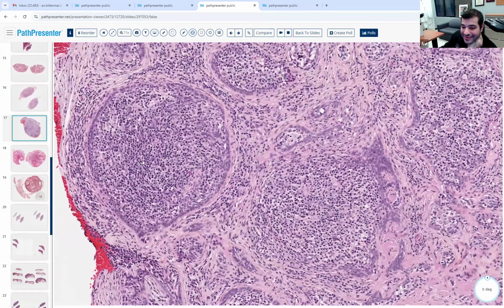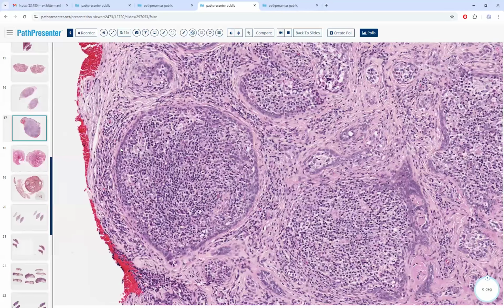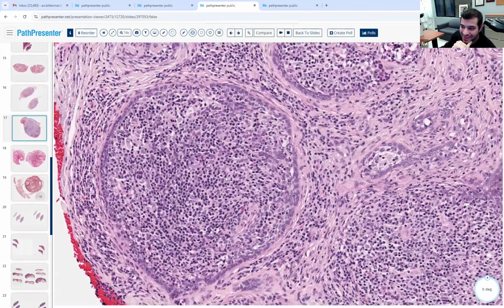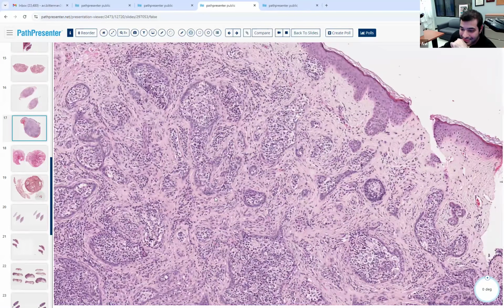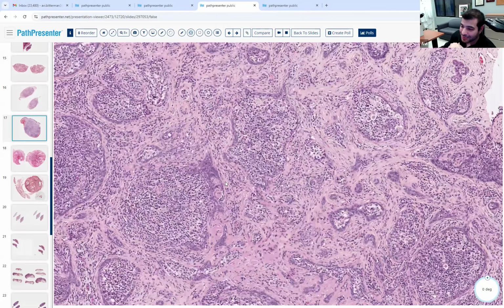There's lymphocytes. And where are the lymphocytes? What's surrounding them? You see this thing surrounding the lymphocytes? A fibrous stroma surrounding, but not just the fibrous stroma. Look at this lining, like an epithelial lining. There are cells that are lining this area, and in this area, they're peppered with lymphocytes. Similar stroma, though. What's your stroma? Fibrous. Similar stroma to that trichoblastoma we just saw.